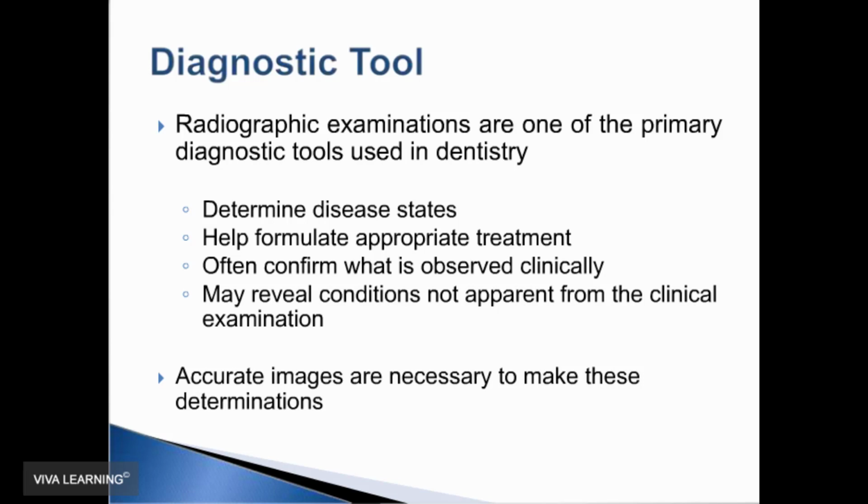And many times they reveal conditions that are not apparent from the clinical examination. In order to use them successfully and get the most information out of them possible, they need to be high quality and accurate to make these types of determinations.